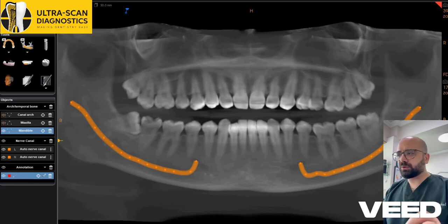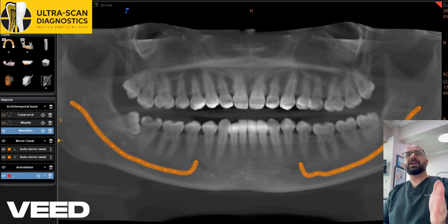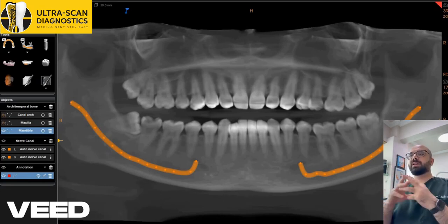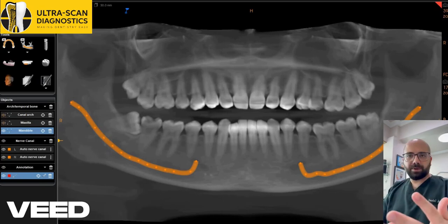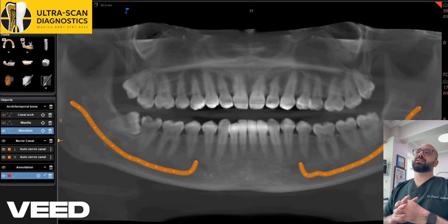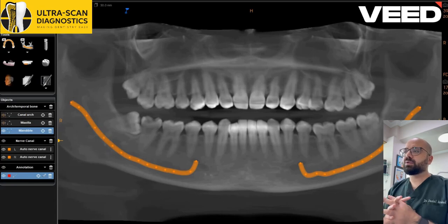The last note that I will have for the audience today is that CBCTs will always be the gold standard when you're doing your treatment planning. Please make this a part of your treatment planning modality so that it helps you identify things, and it helps you gain insight and it helps you plan better. However, if you just want to stick to OPGs, our AI software is approximately 97 to 98% accurate and can help give you that extra knowledge for what you need for your treatment planning.